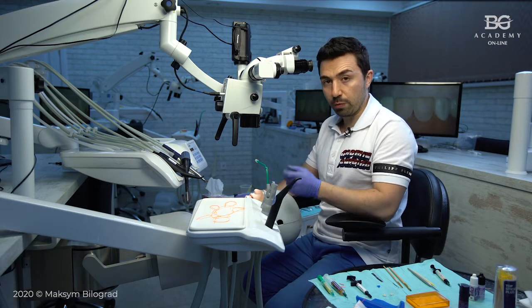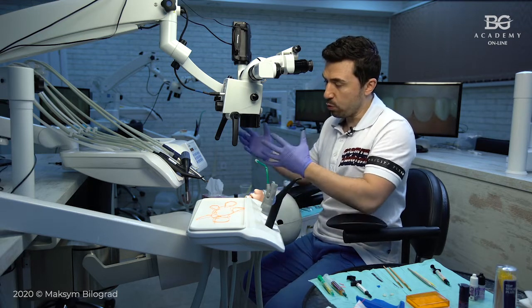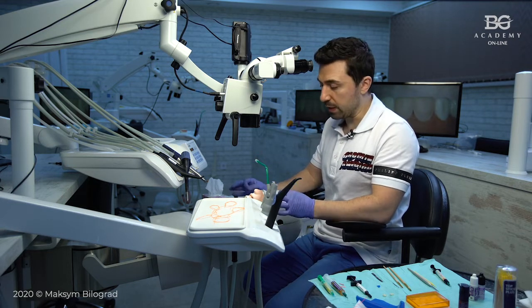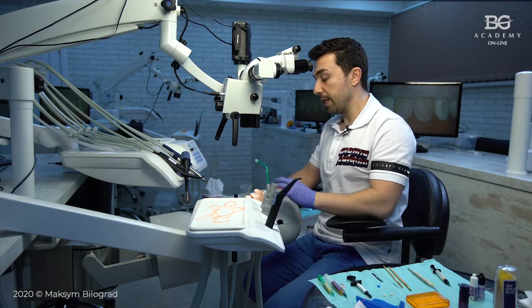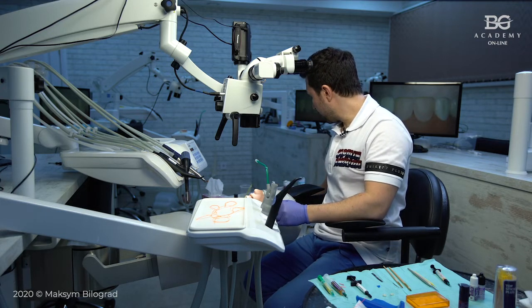But sometimes you may still have some small increments that are pretty difficult to visualize. If you work with a microscope, you can see it easily. But if you don't use magnification, sometimes it's problematic to see these small increments in a really precise way. So there is a small clinical tip.